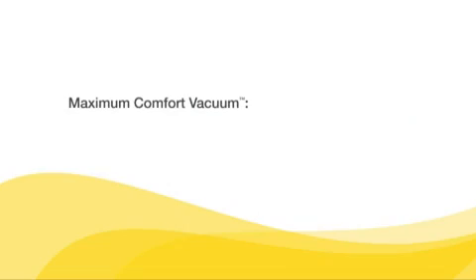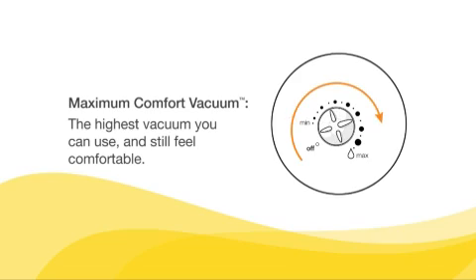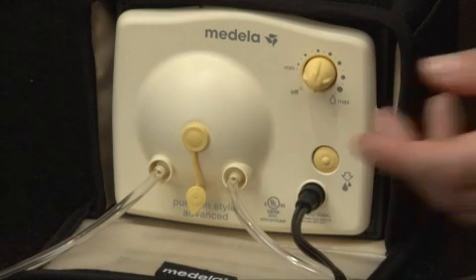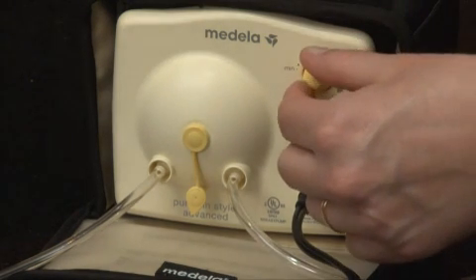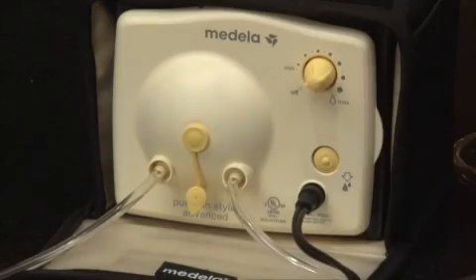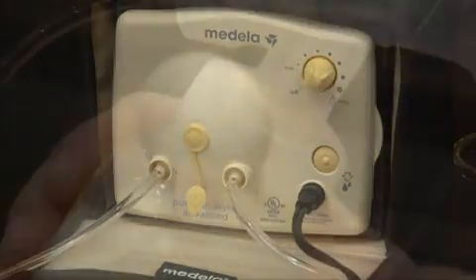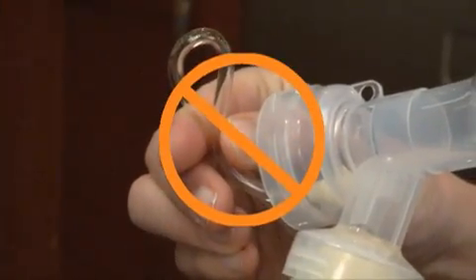Once in the expression phase, set your maximum comfort vacuum. This is the highest vacuum you can use and still feel comfortable. To find your maximum comfort vacuum during the expression phase, increase speed and vacuum using the dial until pumping feels slightly uncomfortable but not painful, and then decrease slightly. Remember, do not tilt or overfill the bottles while pumping, and be careful not to kink tubing while pumping.